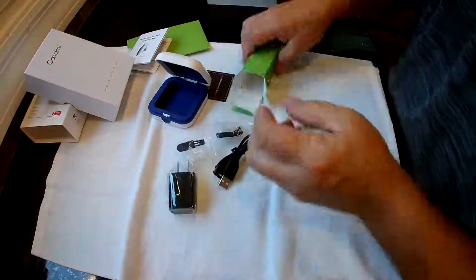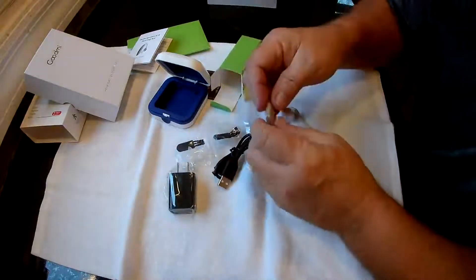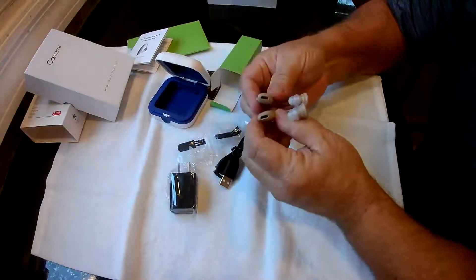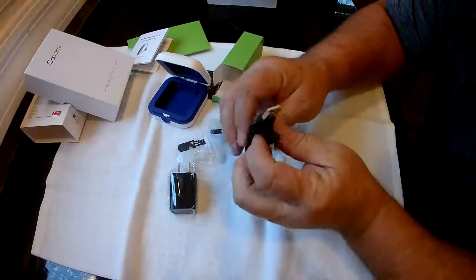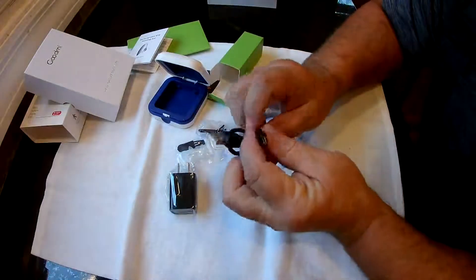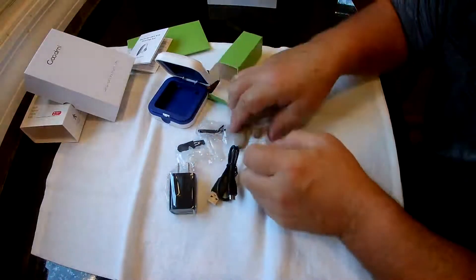The charging cable is a micro USB — you probably have a hundred of these already. You can only charge one at a time since there's a charging port at the bottom, but if you have two cables with two plugs you could charge both at the same time.